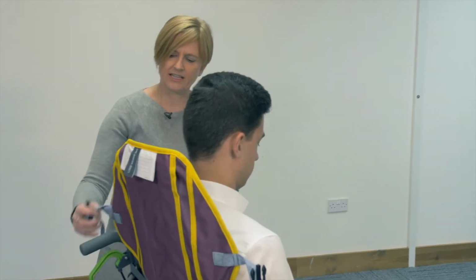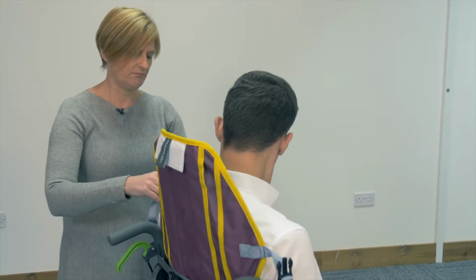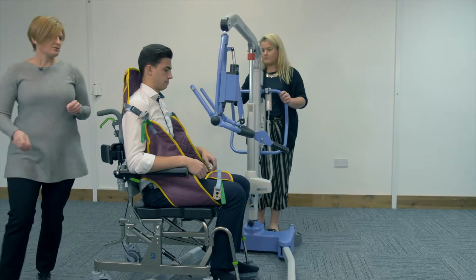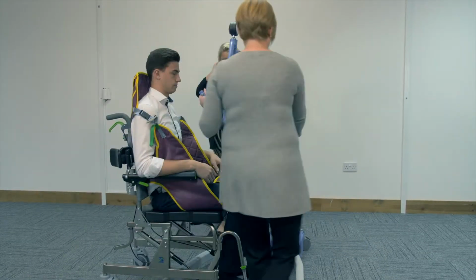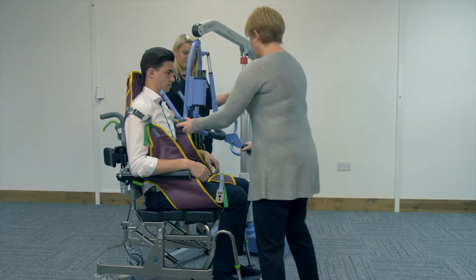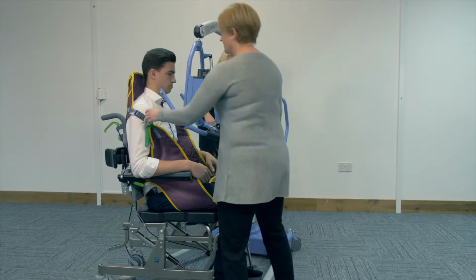I'll just put the head support clips on, so that clips into position. Then the head support will provide a little bit of support in that position. So then if we bring the hoist in and we attach the sling to the spreader bar, we just need to lower it down a little bit more.